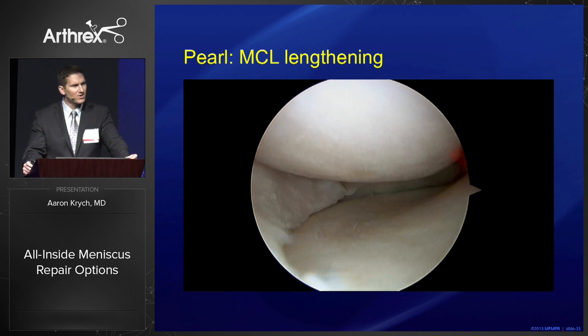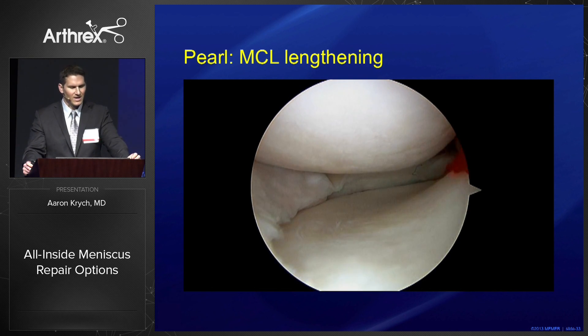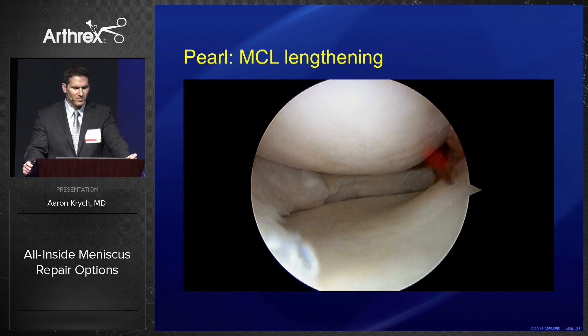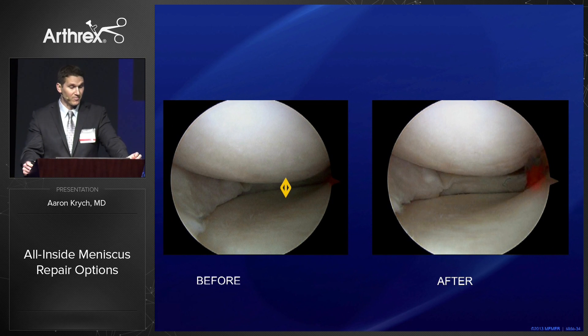If you get into a tight medial compartment, one pearl is to consider performing an MCL lengthening with the knee in valgus. You can pepper the femoral-sided portion of the MCL to give you two to three millimeters of opening, turning it from mission impossible to something very accomplishable.